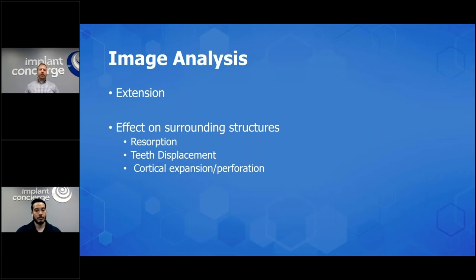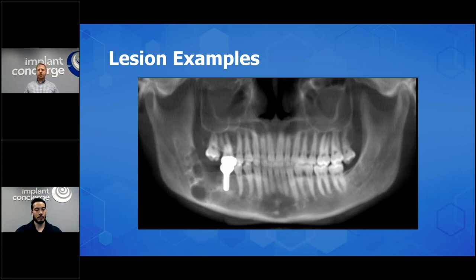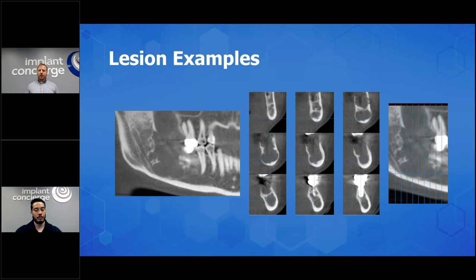Let's go through a few cases. I'm not going to give you the diagnosis on this one yet — I want us to focus on the description. Location: right mandible. It looks low density, multilocular. Here are some cross sections: interruption of the alveolar ridge. You can see it's a lower density — soft tissue density. It's not affecting the implants, but it does look like it's interrupting the mandibular canal.